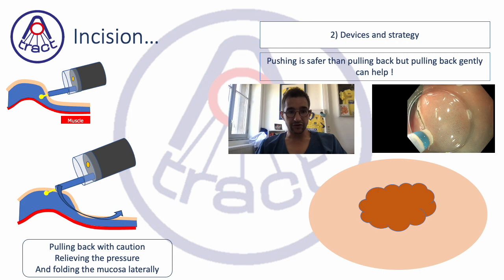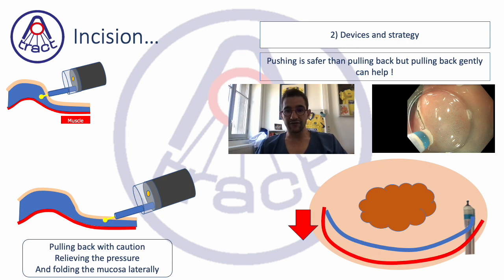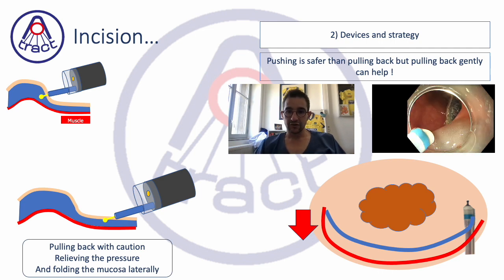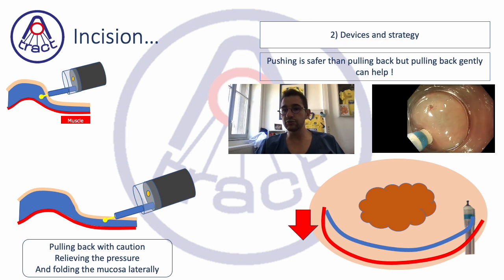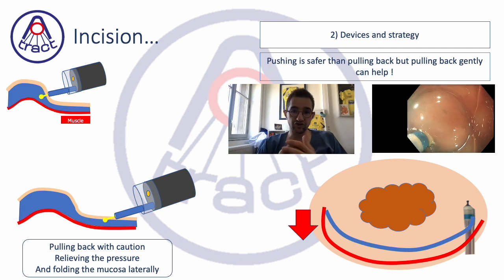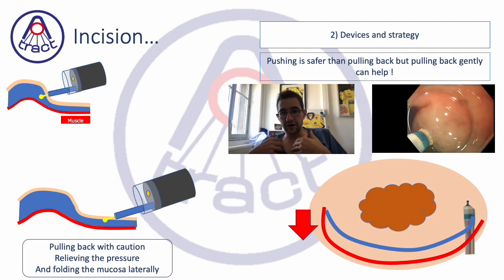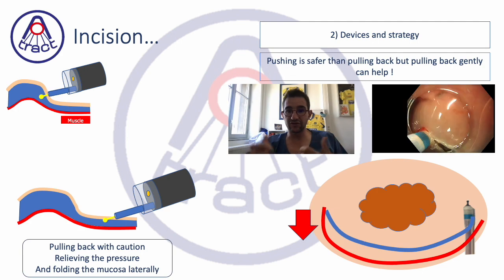Pulling back is once again more dangerous because you go toward the muscle. You should have a movement that is more lateral than a straight pull-back if you want to be safe. For example, you can do a kind of traction but by reducing the pressure and reducing the puckering effect. Once you reach the area, try to push again — here we can push more because we are not going toward the muscle. So when you are obliged to use traction by pulling your knife, use light pressure; when you can push, you can increase the pressure and cut deeper, because it is less dangerous to push than to pull.